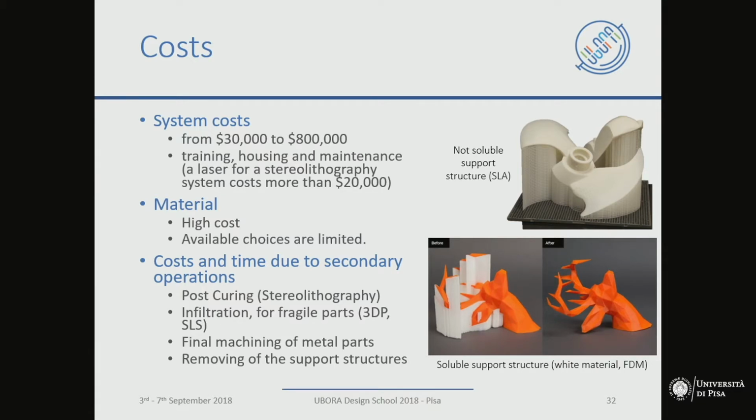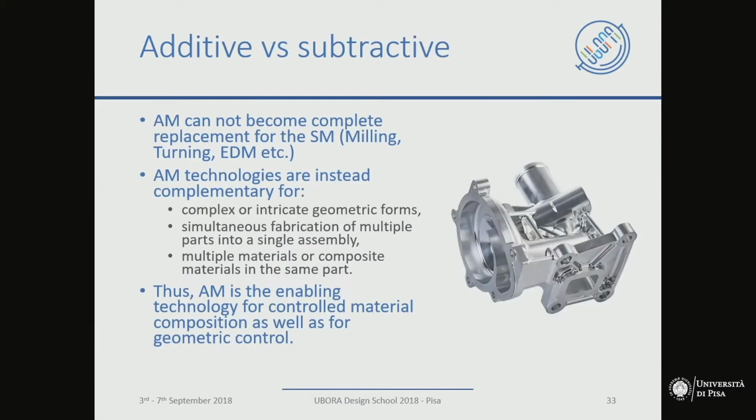So there are some problems with 3D printing. And at the end, consider that there are many other opportunities to fabricate an object. So don't just be stuck on additive manufacturing.